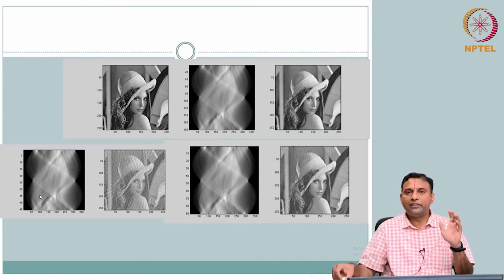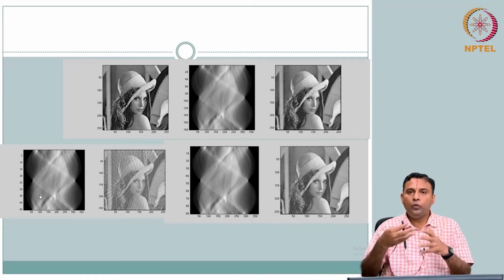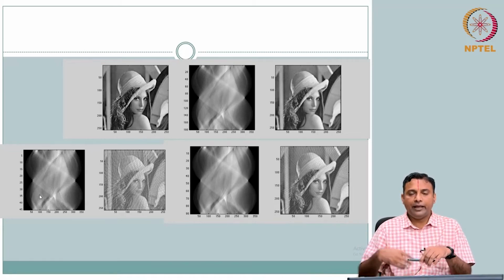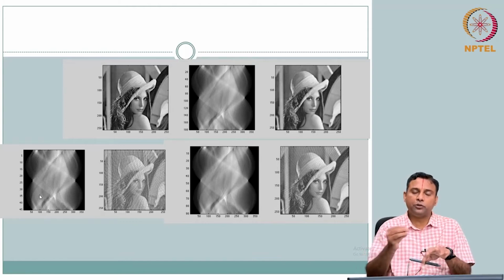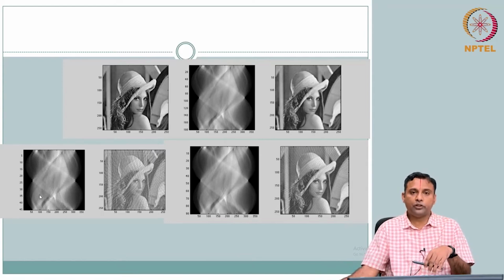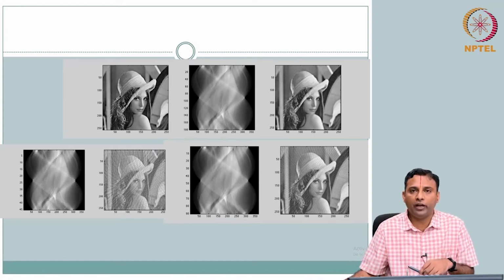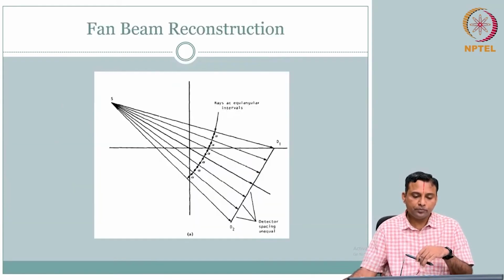So the only major difference is going to be how do we align our data, right? If we get that, the rest of the equations you substitute back in the way we did the back projection algorithm for parallel ray, you have to modify that, okay? We will not go too detailed in this because it will be an advanced topic if we really go into the detail, but just for completeness we will highlight where you have to modify, and what happens if you modify.